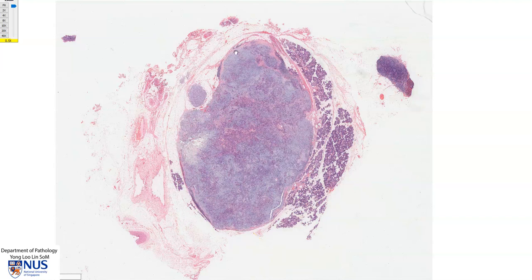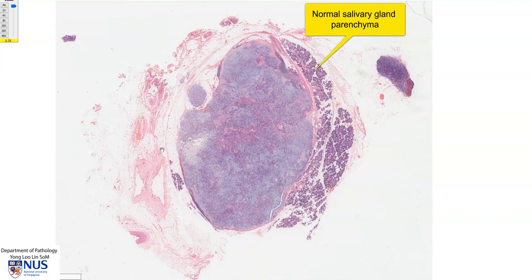Adjacent to this nodule on the right side, we can see some lobules of normal salivary gland parenchyma, and then in other areas as I'm outlining here, we can see a lot of adipose tissue. If you're wondering what this is, this is a small reactive lymph node.